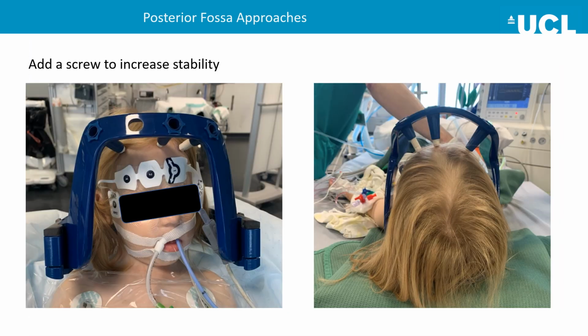Now if you have small children, it can help to add an extra screw because of the extreme rotation that makes this whole approach a bit less stable. However, I don't know if it really helps, but it certainly gives you a better feeling.